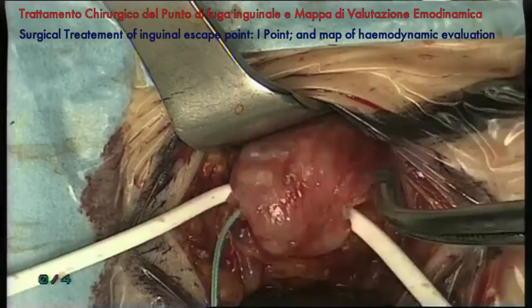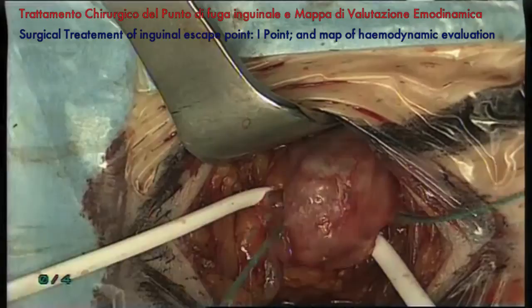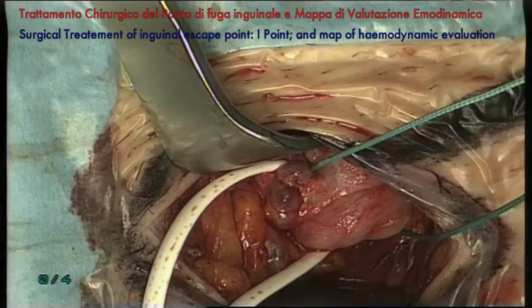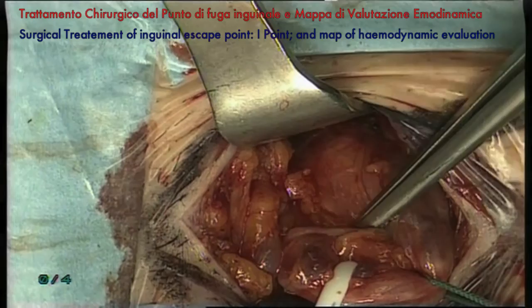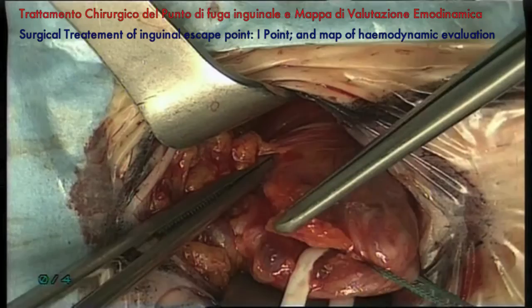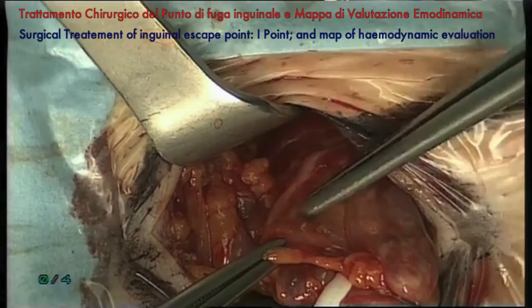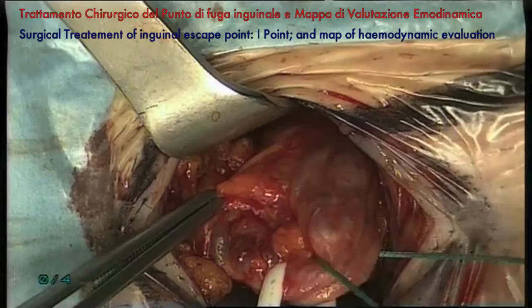The doctor asked the patient whether she's feeling some pain. Take it, Paolo. Rodolfo, take it together. Keep it pulled like this. So, to sum up, this is the genital crural nerve. Keep it there, Paolo.